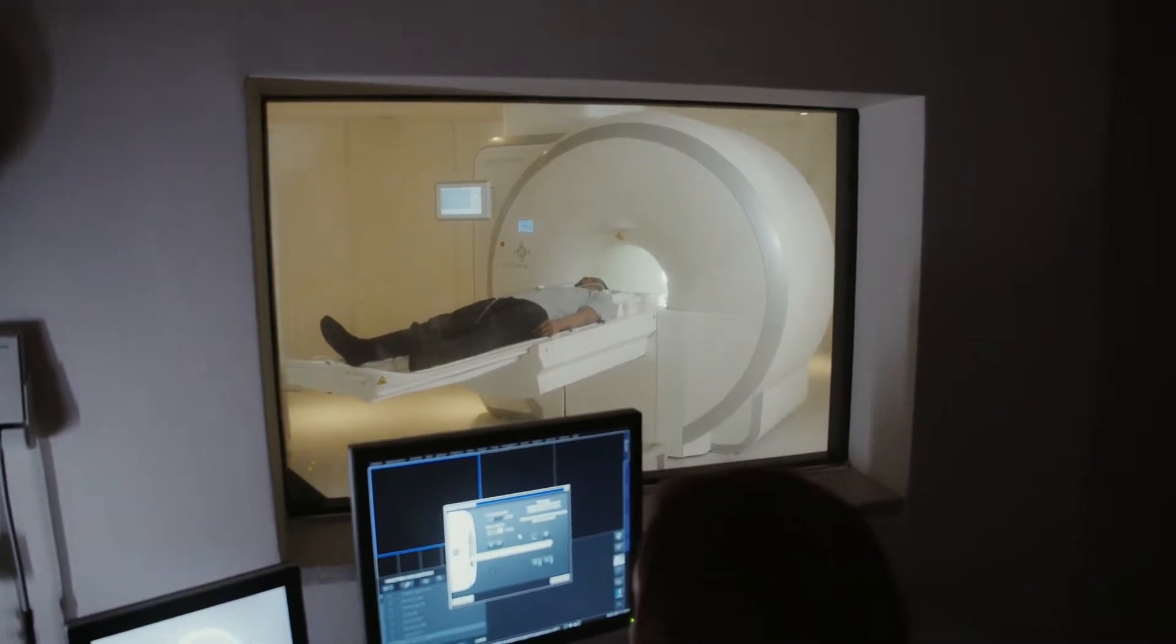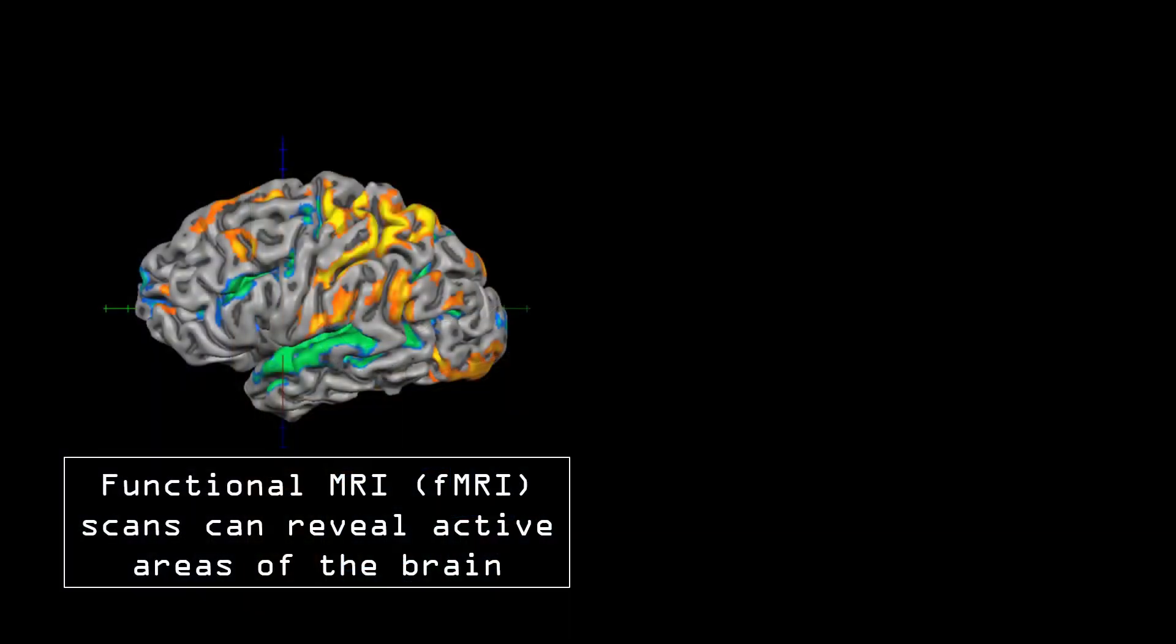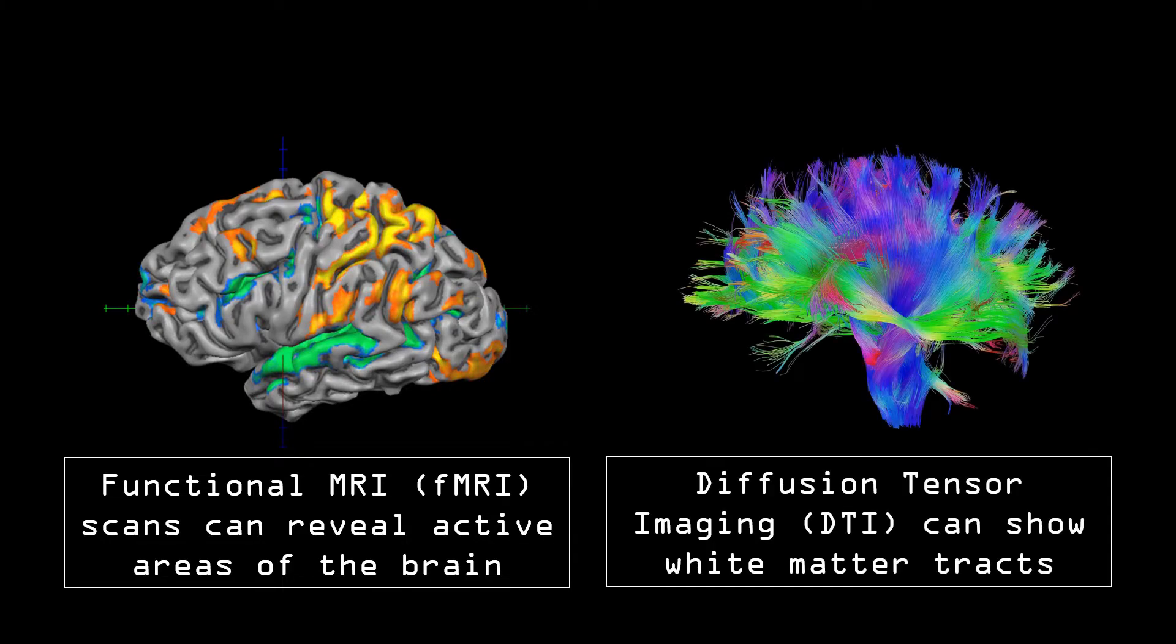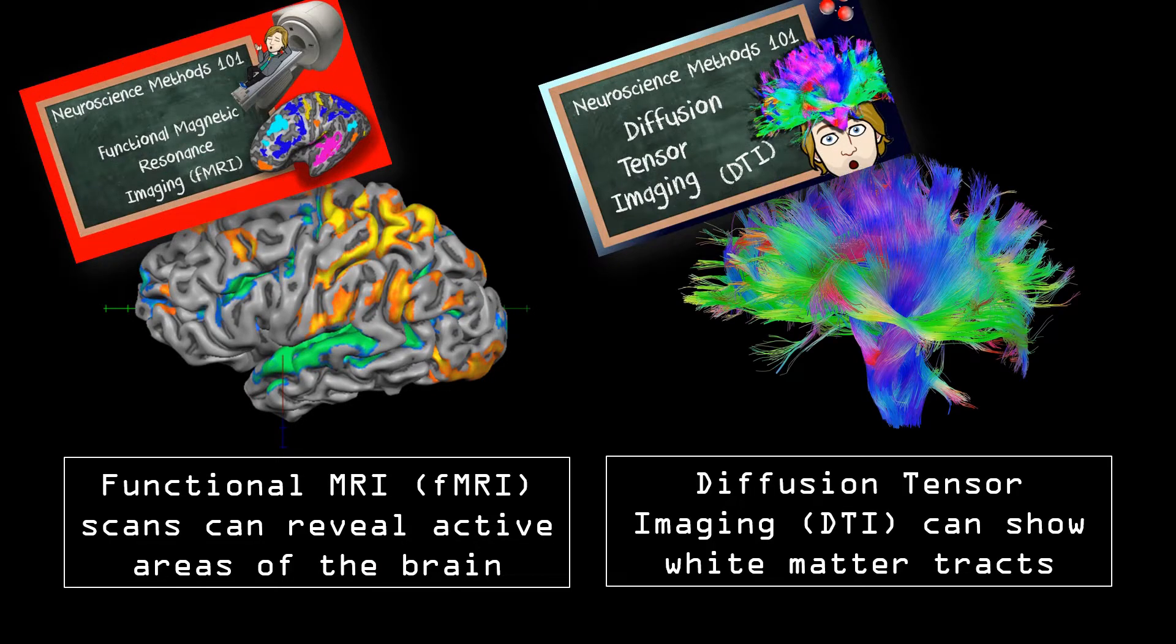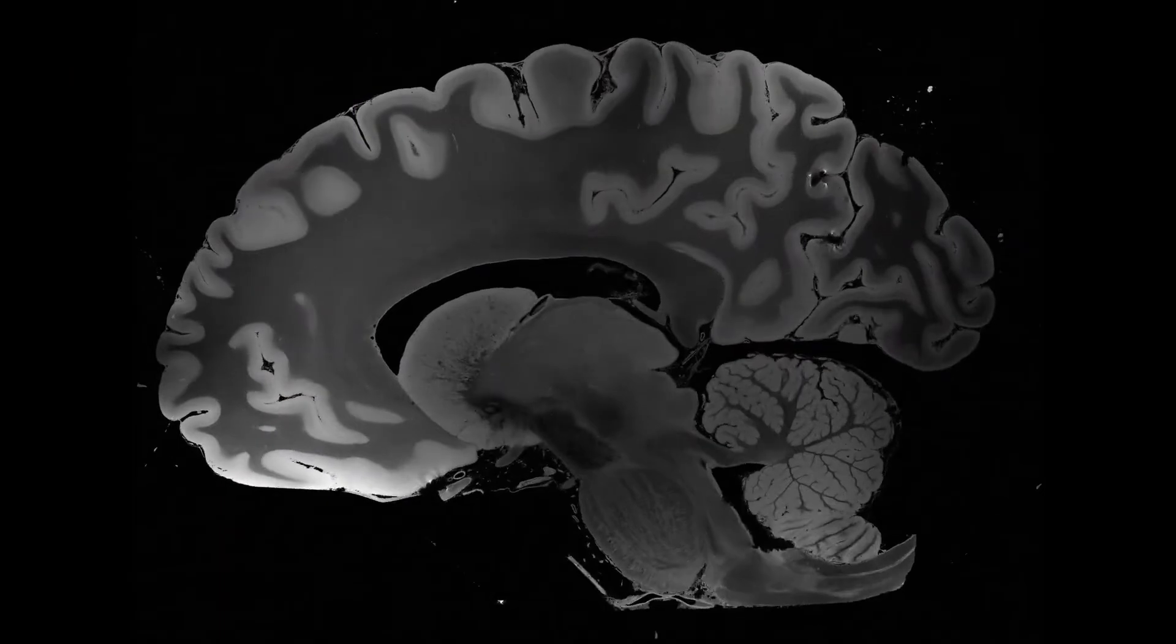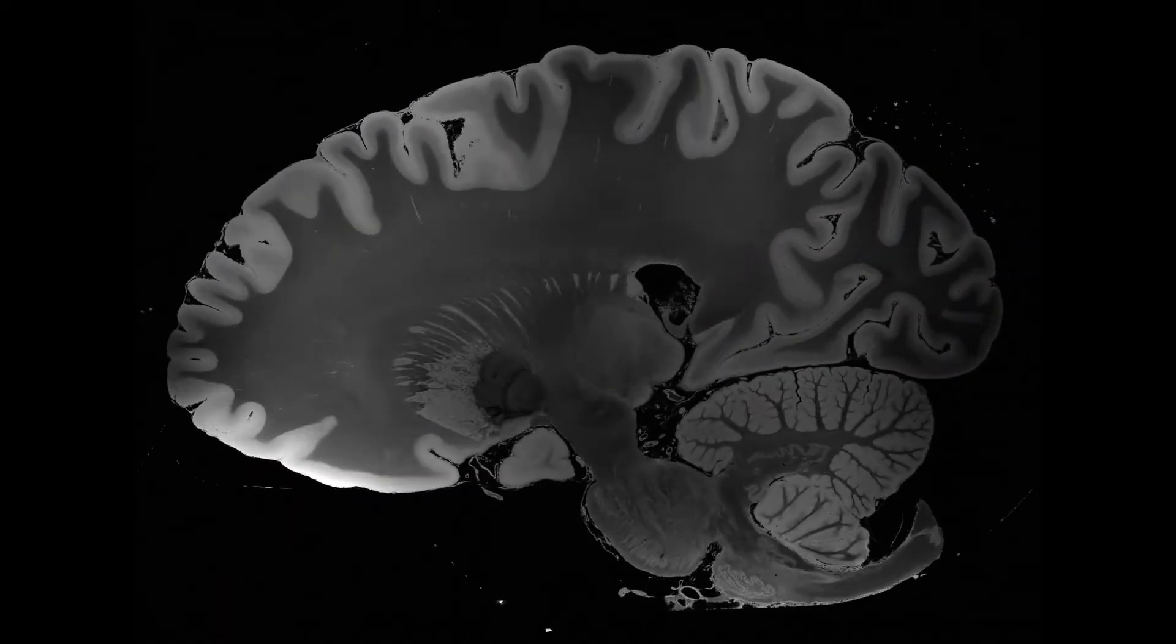Now you can do a lot of things with an MRI scanner, such as measuring brain activity or looking at where all nerve fibers are going, but the most common use is to make a structural MRI scan. So let's take a look at how that works.